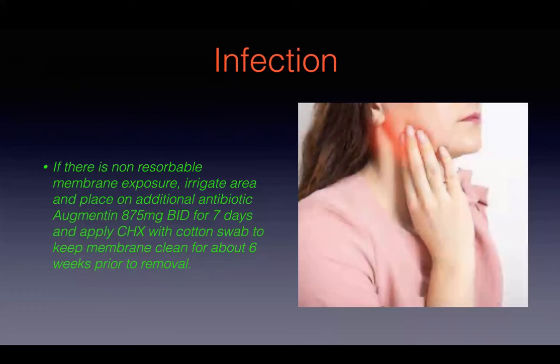I can use the root membrane technique. We only saw the kit on the screen. I didn't have the film on that one. You can go to the website and see the video on it. For the sake of time, I didn't have the time to show the video on that.